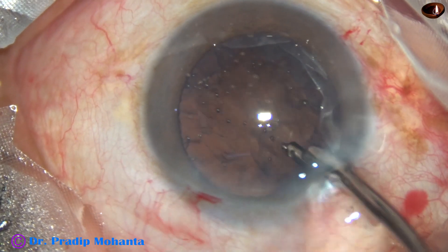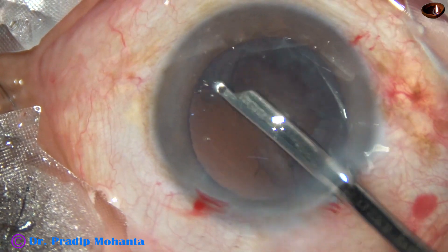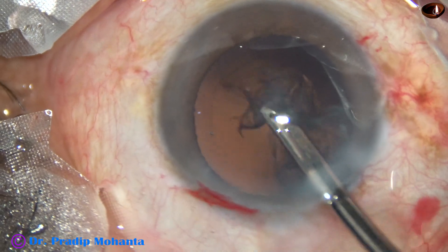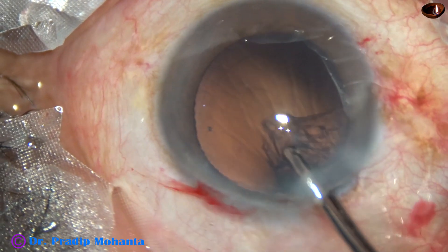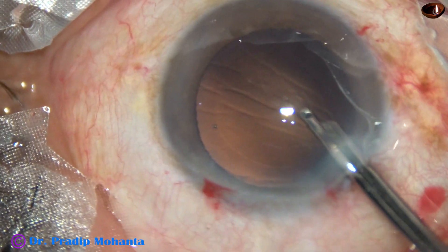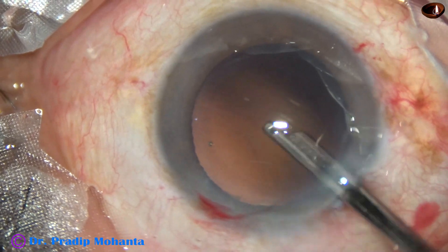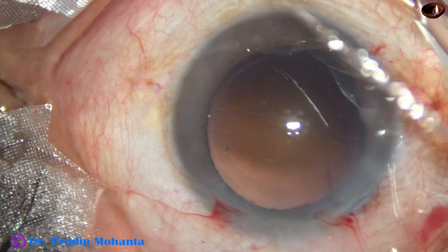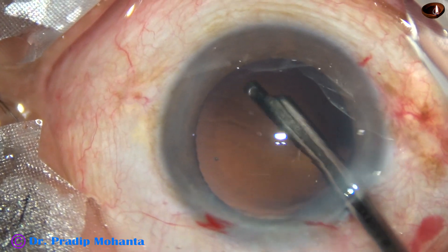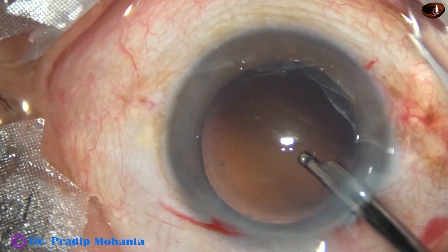Aspirate the epinuclear shell more safely. In this case, I am using a 23-gauge Simcoe cannula as a coaxial I/A, and I could remove the cortex all around — 360-degree cortex removed through the main incision itself. This is a bit of polishing of the posterior capsule, which is very nicely cleaned with no cells remaining.